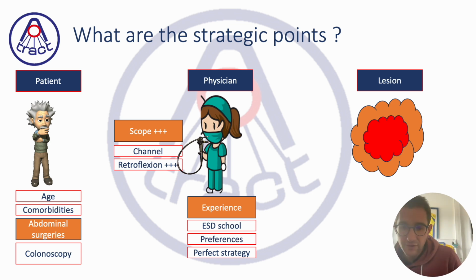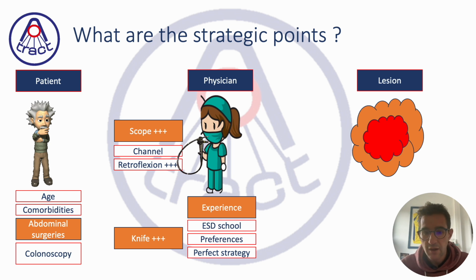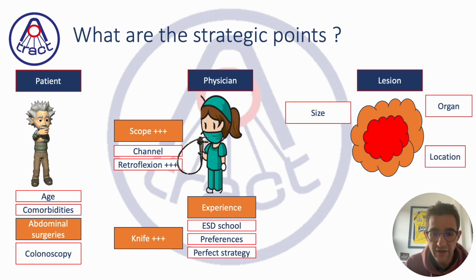What are your preferences about strategy, and what is your usual perfect strategy? What is your favorite strategy? I mean, everything underwater, everything with traction when it helps. Finally, which type of knife? Is it a needle type knife or an insulated tip knife?